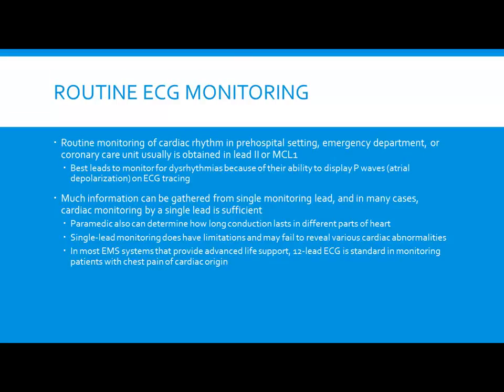And again, why is lead 2 a good, just basic monitoring lead? What does it look at? Not the left ventricle, not lead 2. Its axis pretty much goes down the normal SA to AV to the ventricles, all right? So it's not a perfect system, but it gives you a better look at that, okay?